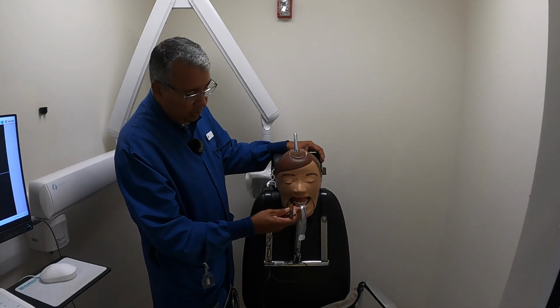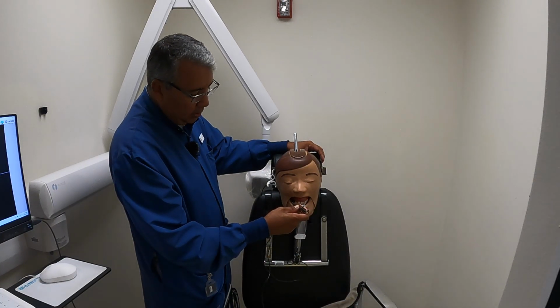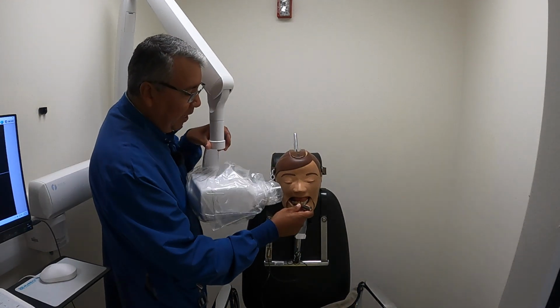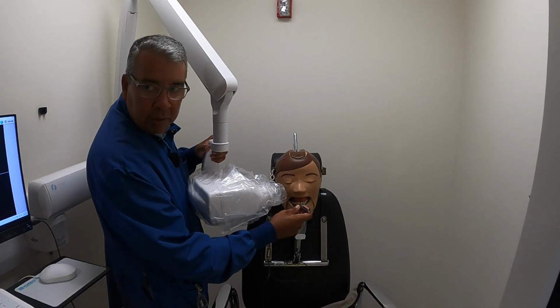It doesn't come in straight, it doesn't come out like this. I'm leaning that horizontally up against the buccal surfaces of all those teeth, and that's the angle that I get. So I would take my PID and rotate it to where the face of your PID is in the same direction as that horizontal angle.